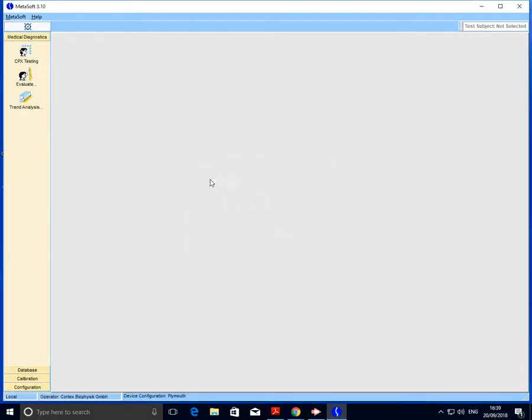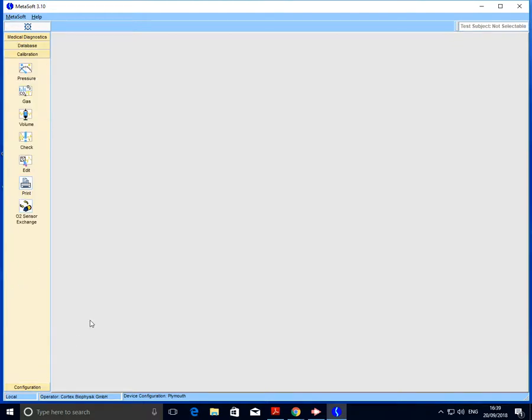Once we're in the software, we're presented with a number of options down the left hand side. Initially what we want to do is head to the calibration tab. The calibration procedure is threefold: we have pressure, gas, and volume. I'm going to go ahead and calibrate the pressure first.